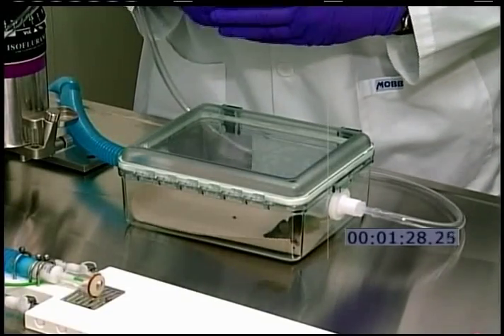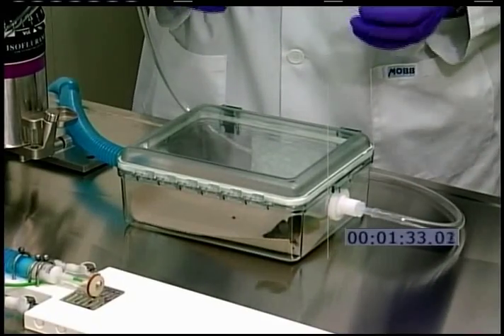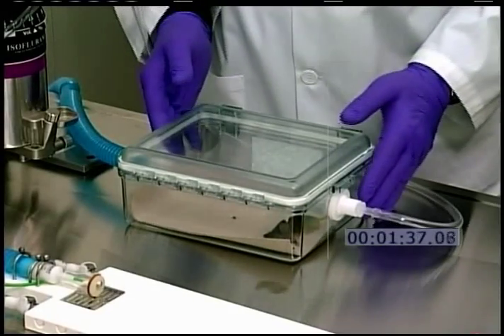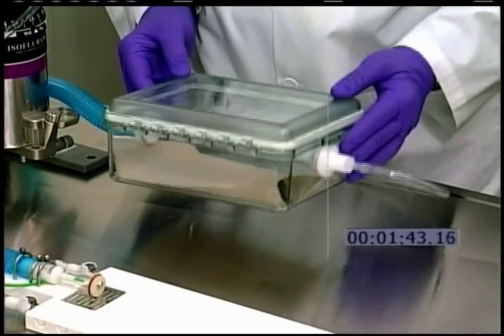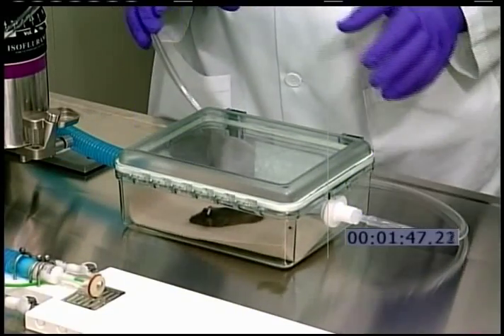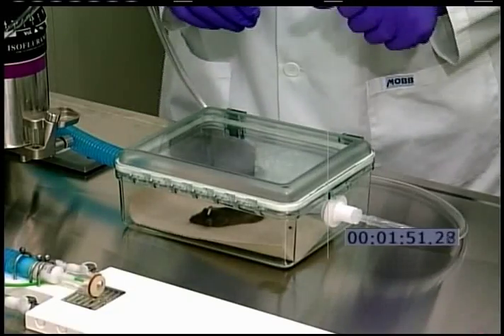We have several different planes of anesthesia, but in this particular case, what we look for to ensure that the animal's in the surgical plane of anesthesia is, number one, no movement. Number two, we see his respiratory rate drop. We can see his heart rate drop. And probably the best key is if I try to turn him over by tilting the induction chamber, he won't respond and he won't try to right himself.